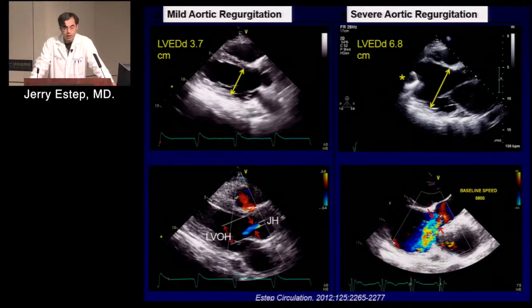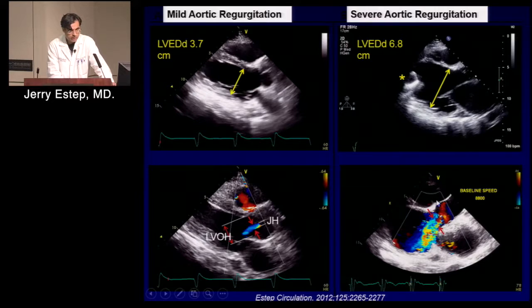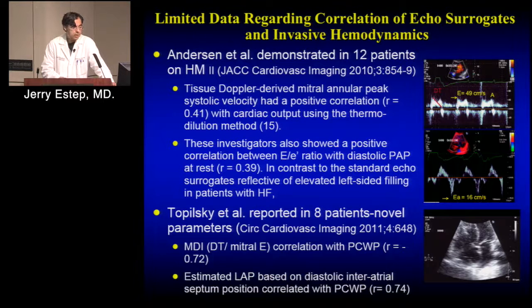But when quantifying AI, use your standards, put forth by the recent ASE guideline document. But it's important to know the company it keeps. And so it could be challenging in terms of these eccentric jets. I particularly like the jet height to LV outflow tract height. But when you have eccentric jets, we like to lower the pump speed and see how big the LV is. Because when it's real, the LV size is not coming down as what would typically be expected in someone with moderate or more AI.